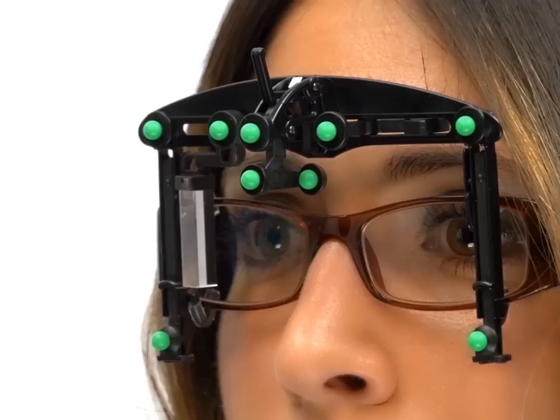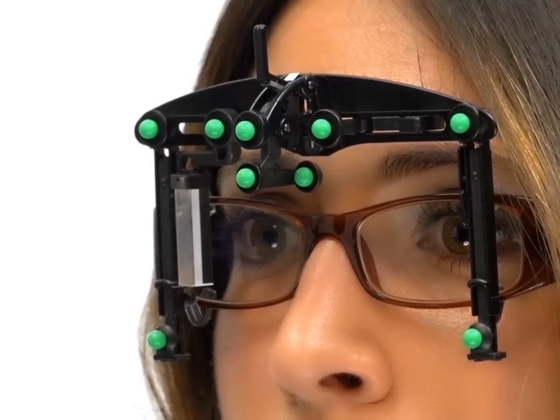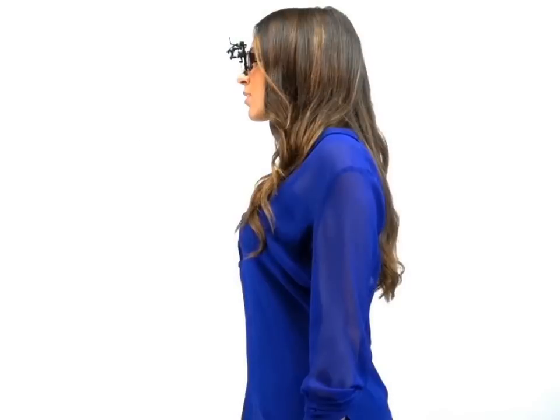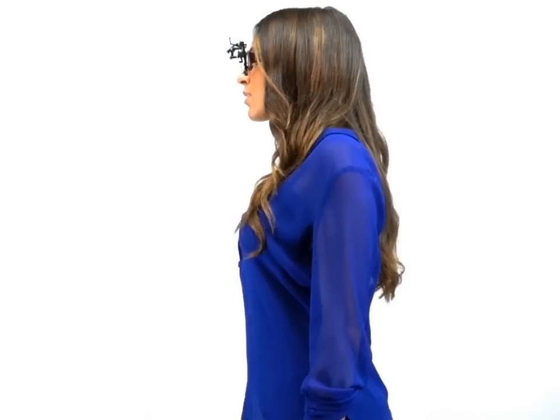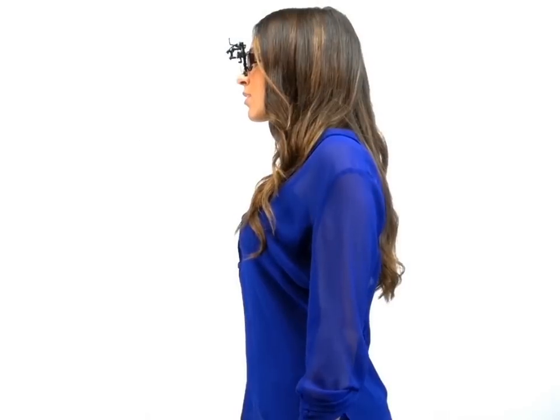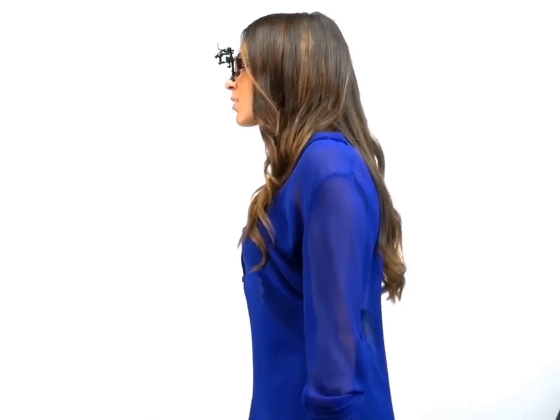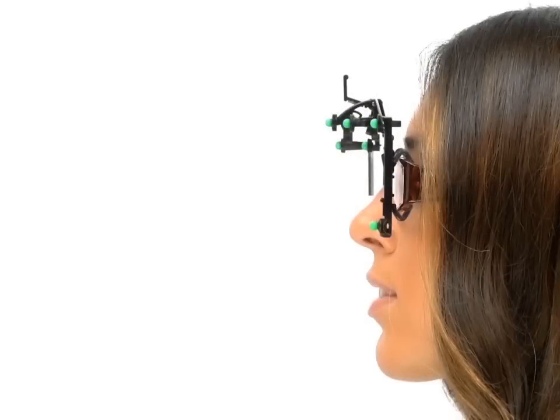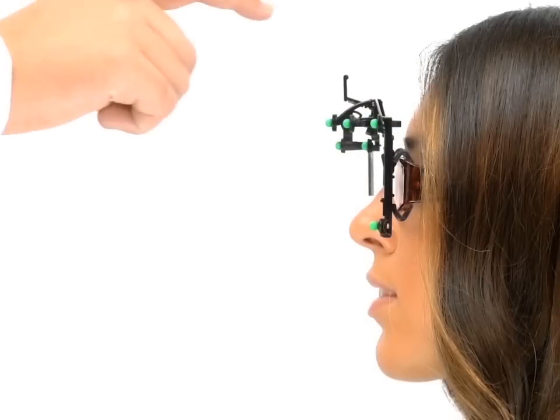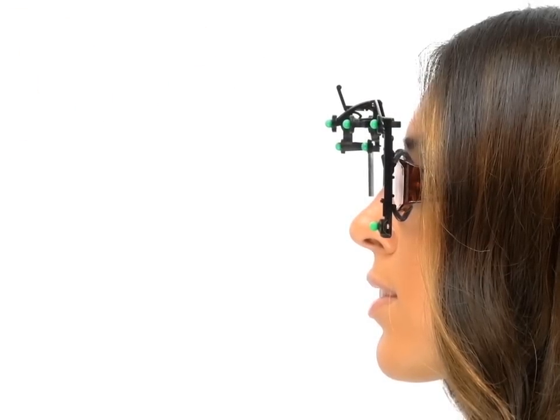The patented posture swing assembly allows the height measurements to take into account the patient's natural posture. First, unlock the swing assembly by lifting the brake arm. Next, make sure that the patient assumes their natural posture. You can either capture the patient's standing posture or their sitting posture based on the patient's lifestyle.